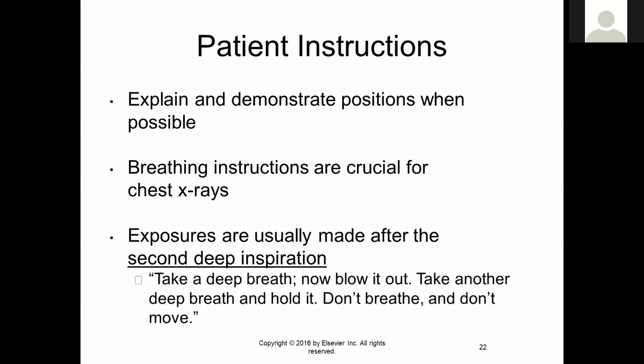Take a deep breath in. Now blow that air out. Take another deep breath and hold your breath. Don't breathe, don't move. Then you'll make your exposure. Or in the case of a lab, you will make a simulated exposure.